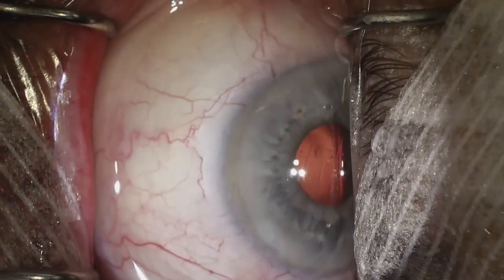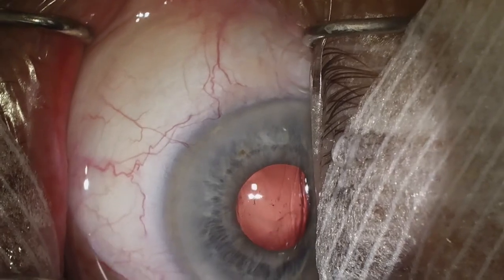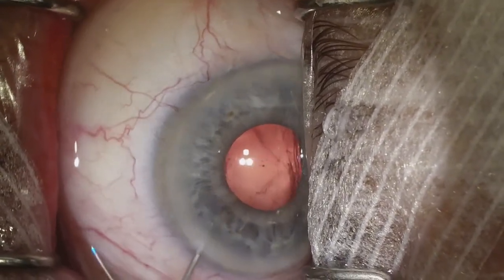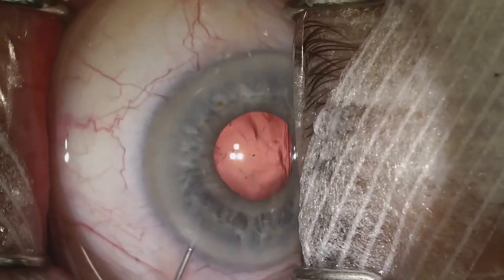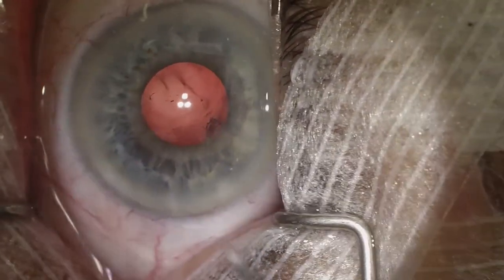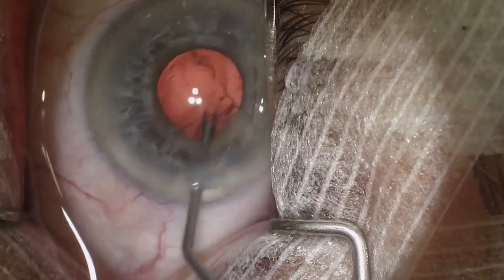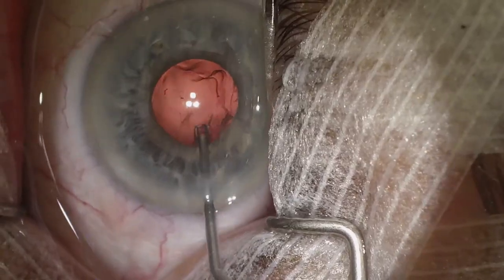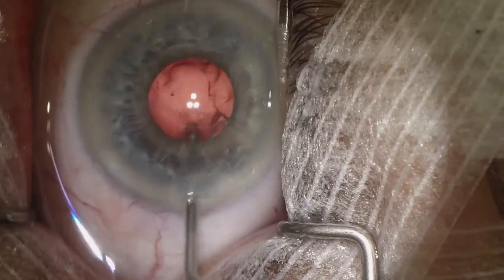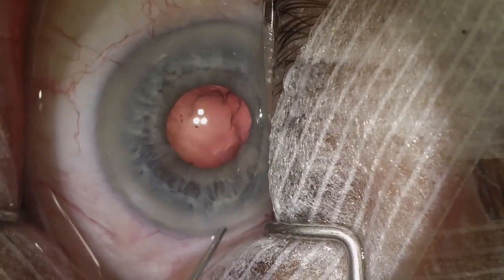The patient is under topical anesthetic and will close their eye, so the pupil will rotate up. What I did there is I just hydrated and made sure there was no material remaining in the wound or the paracentesis. Here is a silicone tip Terry squeegee which we're going to use to polish the posterior capsule and remove any lens fibers that may be on the posterior capsule centrally.